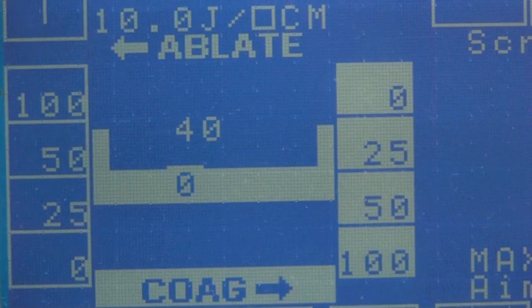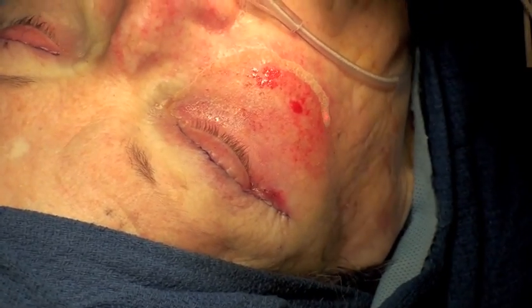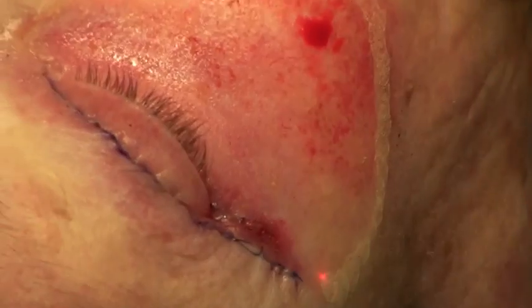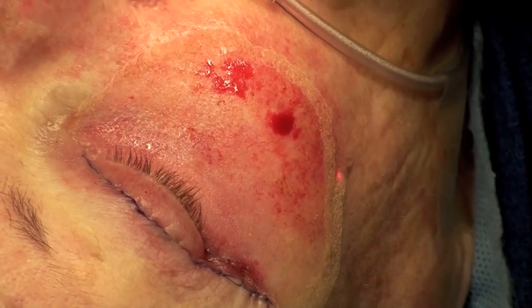Okay, cover it. At this point, we turned off the coagulation and used the laser in a clean 40 microns of pure ablation. What I'm doing here is outlining the border of the resurfaced skin. This creates a transition zone or a feathering, which blends the texture and color variations between the treated skin and the untreated skin.